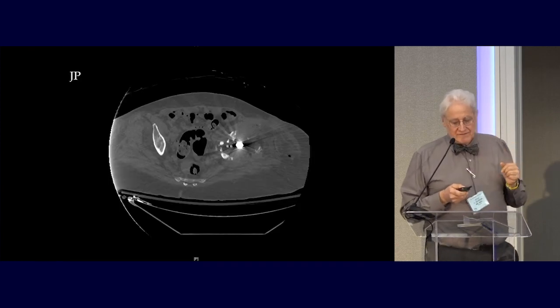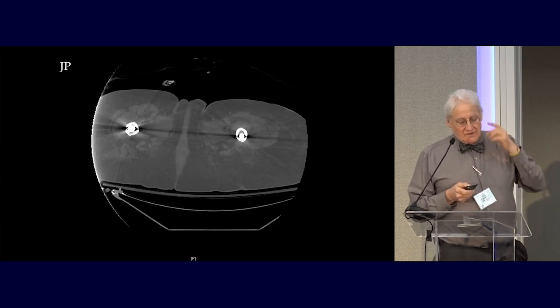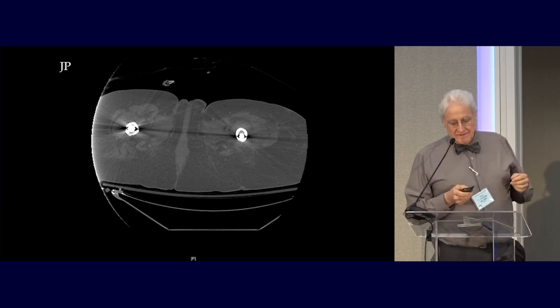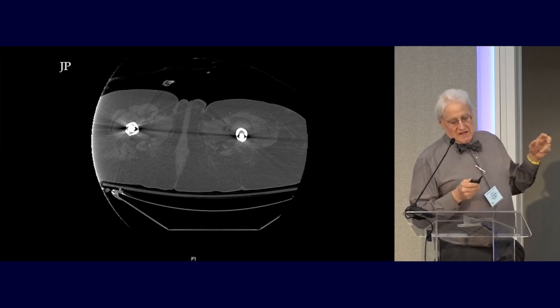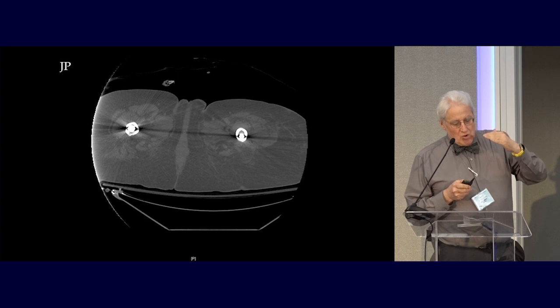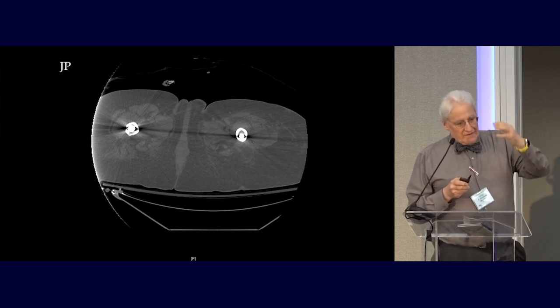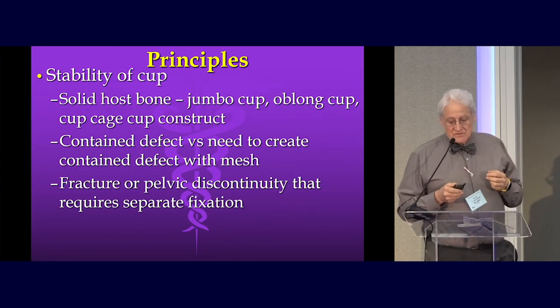So here's his CT. There's really nothing there to repair, so I'll probably have to fix it with some type of allograft that I use once I get the infection. I think it's important to look at the stem, but the picture on the left side shows that spot welding that I talk about. So the bone, even though you might see some lysis on the side, there is some bone that looks like it's really affixed to that prosthesis, and his physical exam goes along with that.